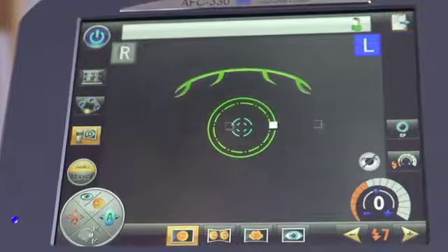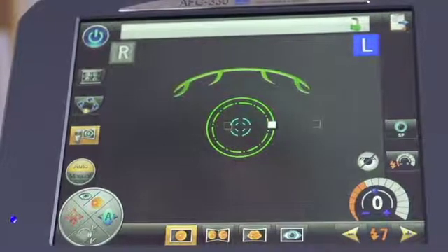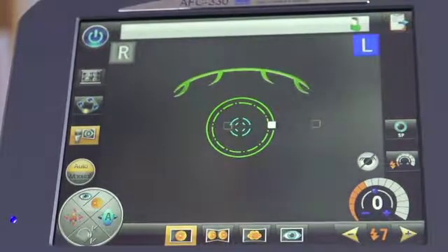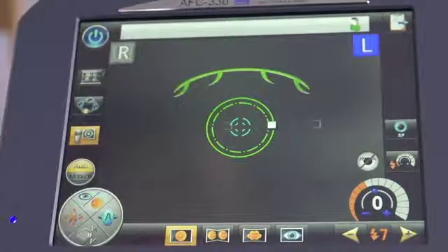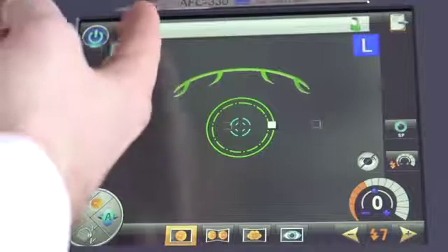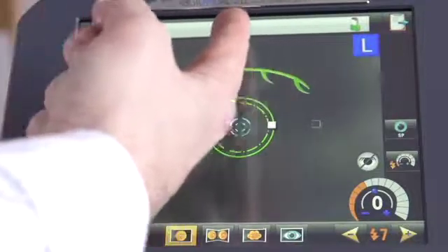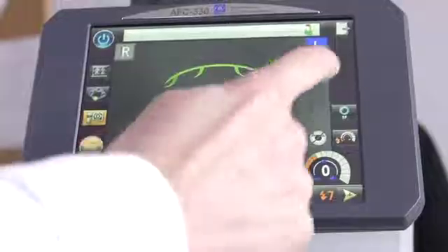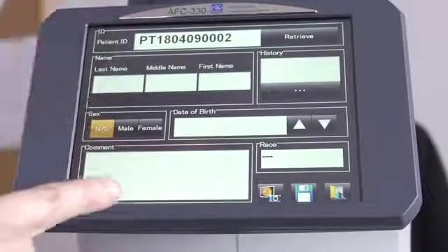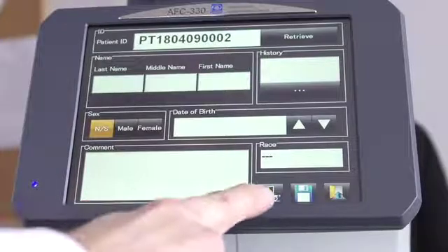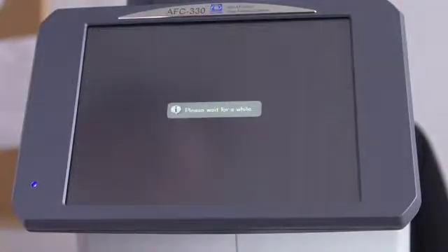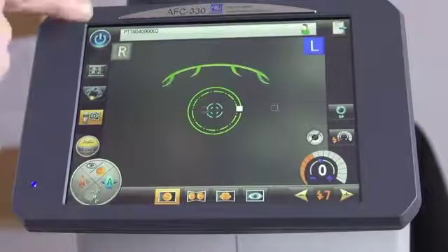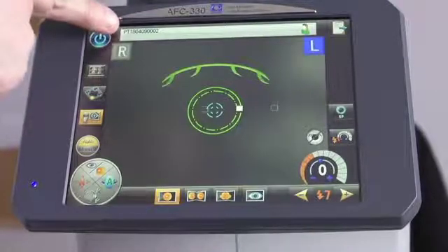So now we are ready to take some photographs of a patient. First of all, before we can take anything we do need to register the details against the patient. We know that that part is active if we have a name or a number in the patient box here. Click on the clipboard icon, fill in the details as necessary, and then click the capture button. You will now see that there is a patient number in the box.